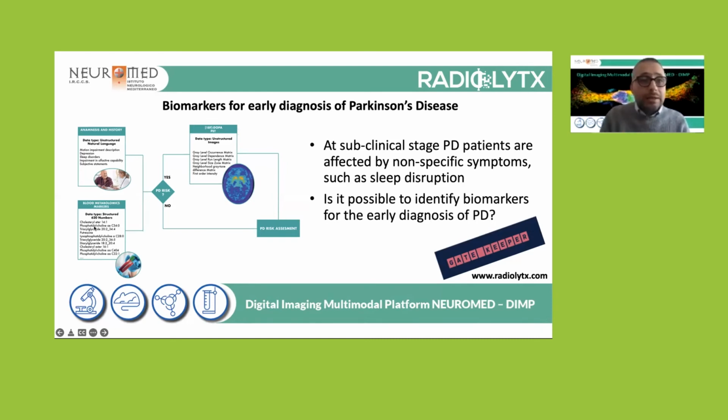We can make blood analysis. We developed a specific blood metabolomic analysis tool, which from 630 parameters may give you a sort of Parkinson's disease risk indication. But if you have such a risk, then we have specific tracers, dopamine tracers, which are binding exactly to the problem which is causing Parkinson's disease. So you can add, at a very early stage, PET imaging. And in that case, you may have a very clear risk assessment.